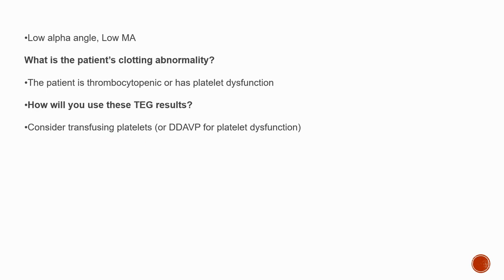What could be the differential diagnosis in this patient? So as per patient clinical history, there is petechiae, there are bruises, so there are superficial bleeds. So it is probably a bleeding disorder due to a platelet function defect.